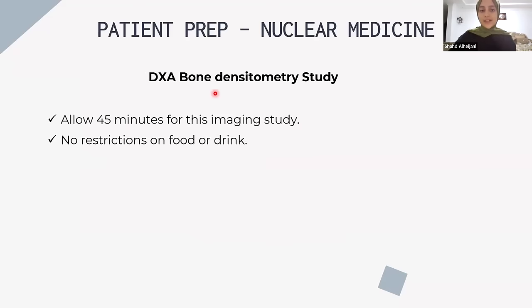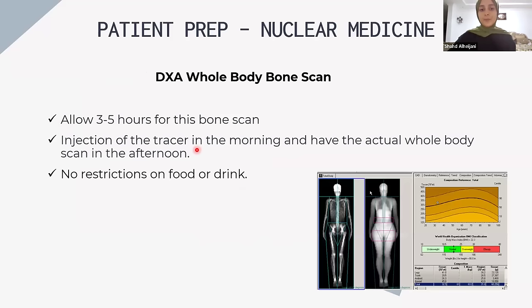Now, the DEXA scan is basically a scan to check the bone density. So this will be 40 to 45 minutes long. And since it's for the bones, there will be no restriction for food or drink.